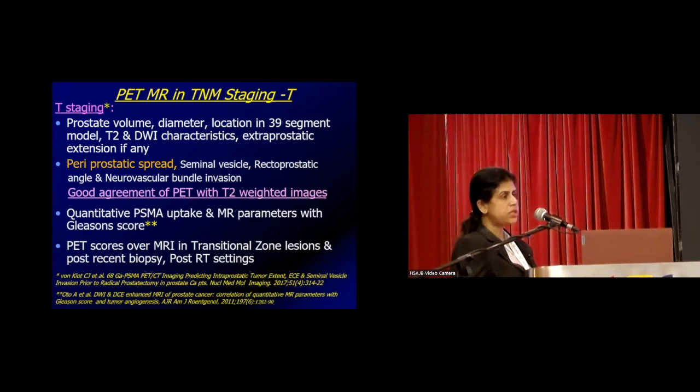What we have found is there is an extraordinarily good agreement of PSMA PET with the T2 weighted images on the PET-MR. It also equally correlates with the Gleason score of the patient. So the more aggressive the disease, the more is the PSMA avidity or the uptake.